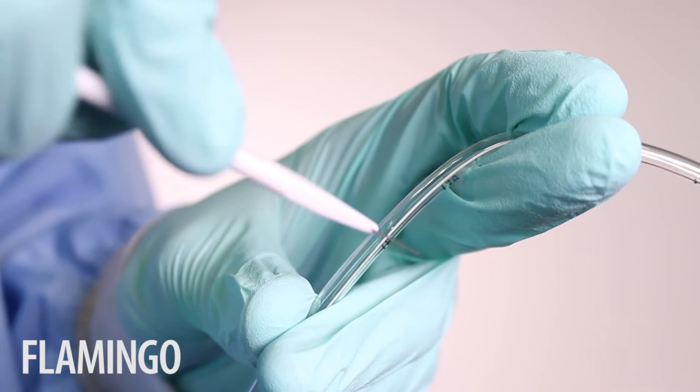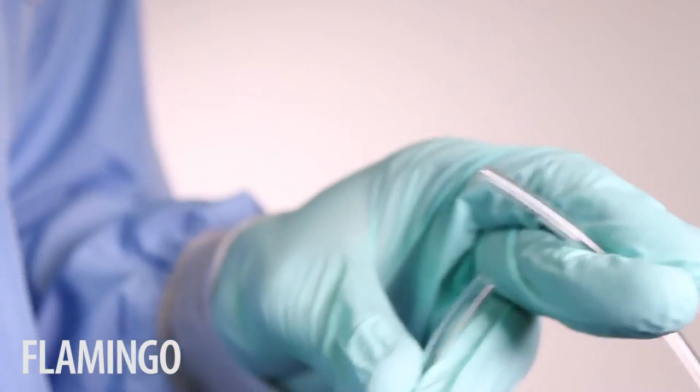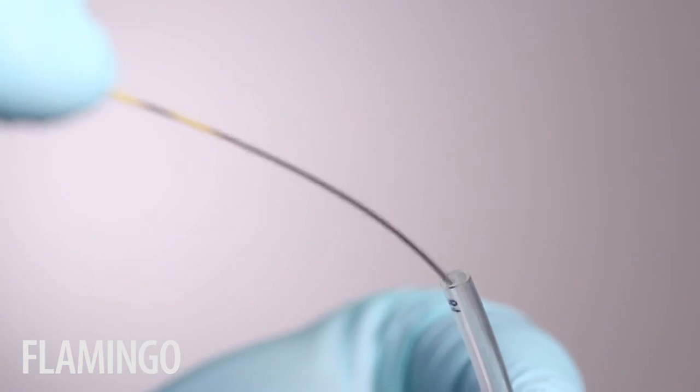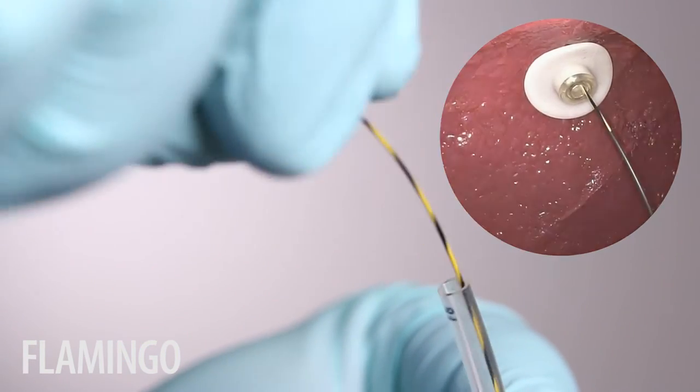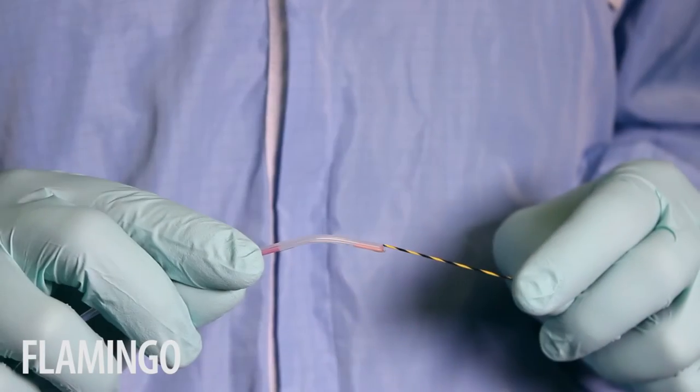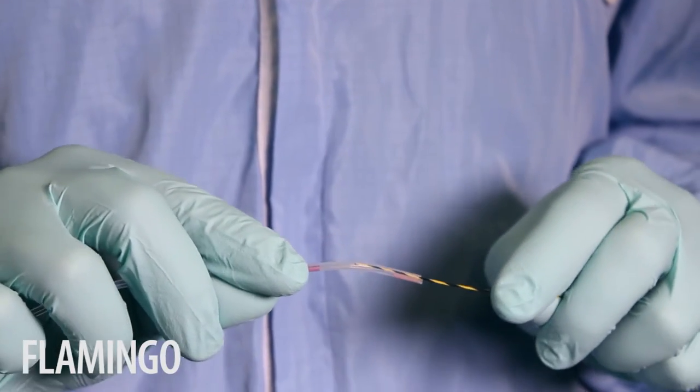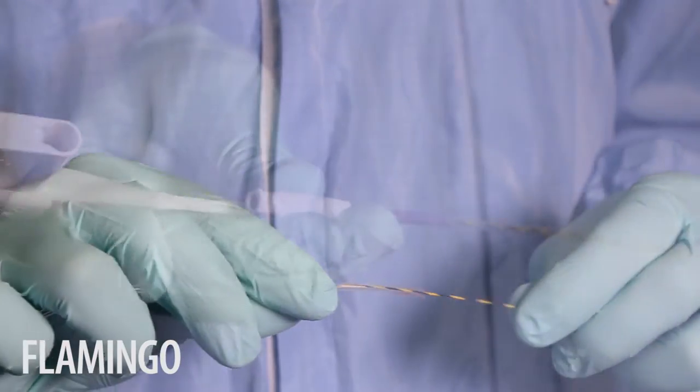Cut through the peg tube leaving between 3 and 5 centimeters of the tube protruding outside the patient. Now insert the guide wire via the peg tube into the stomach. The lumen of the Flamingo can easily be inserted over the guide wire and into the stomach.